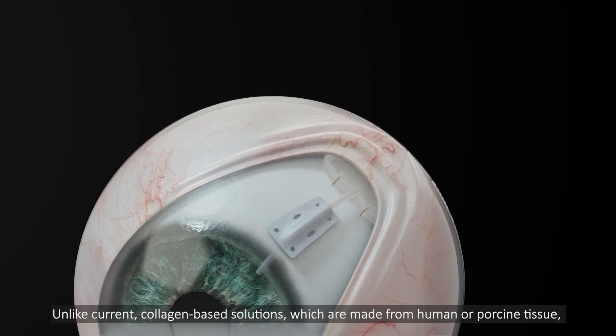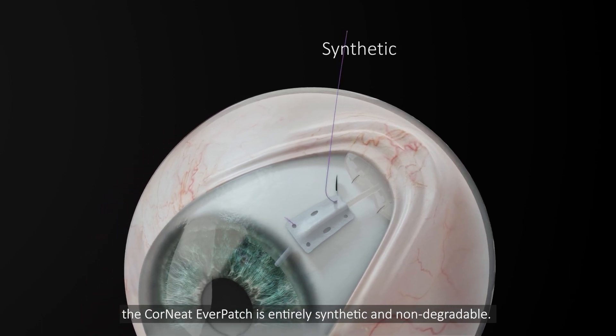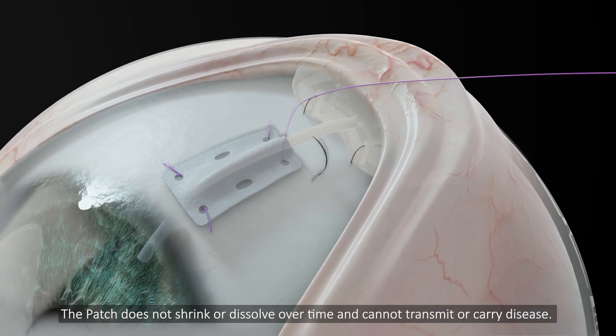Unlike current collagen-based solutions, which are made from human or porcine tissues, the CorNeat EverPatch is entirely synthetic and non-degradable. The patch does not shrink or dissolve over time and cannot transmit or carry disease.